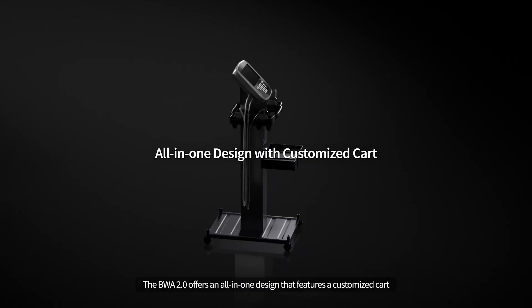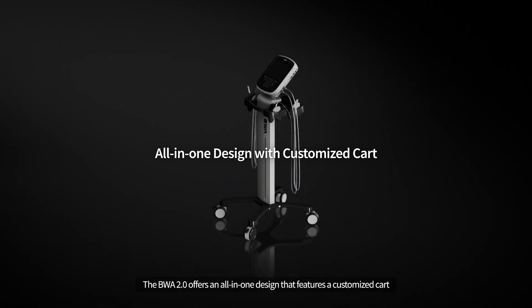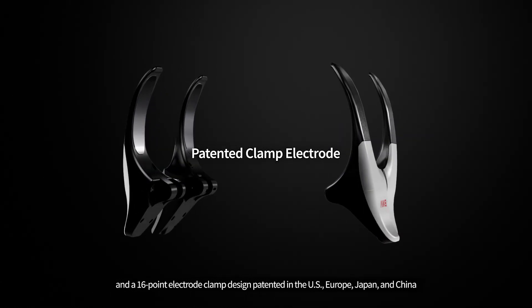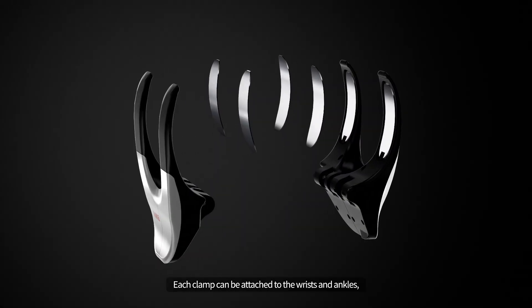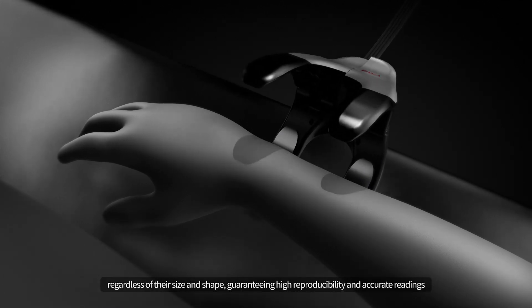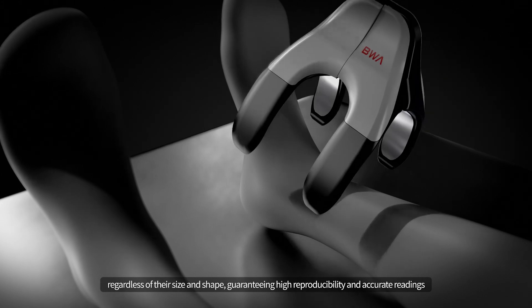The BWA 2.0 offers an all-in-one design that features a customized cart and a 16-point electrode clamp design patented in the U.S., Europe, Japan, and China. Each clamp can be attached to the wrists and ankles regardless of their size and shape, guaranteeing high reproducibility and accurate readings.